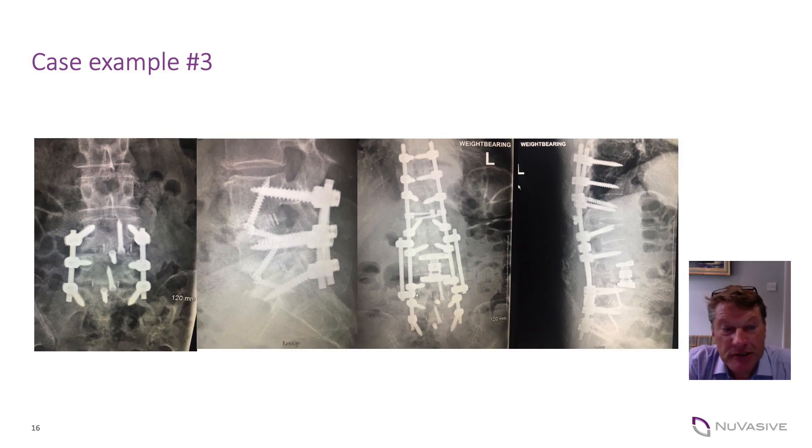This case is an elderly patient who had had a previous lumbar fusion resulting in severe sagittal imbalance. She required initially a lumbar fusion which failed proximally, and then underwent extensive fusion to her proximal thoracic spine combined with a pedicle subtraction osteotomy and a four-rod technique to provide stability and strength. This shows the versatility of the system and its adaptability across multiple pathologies.